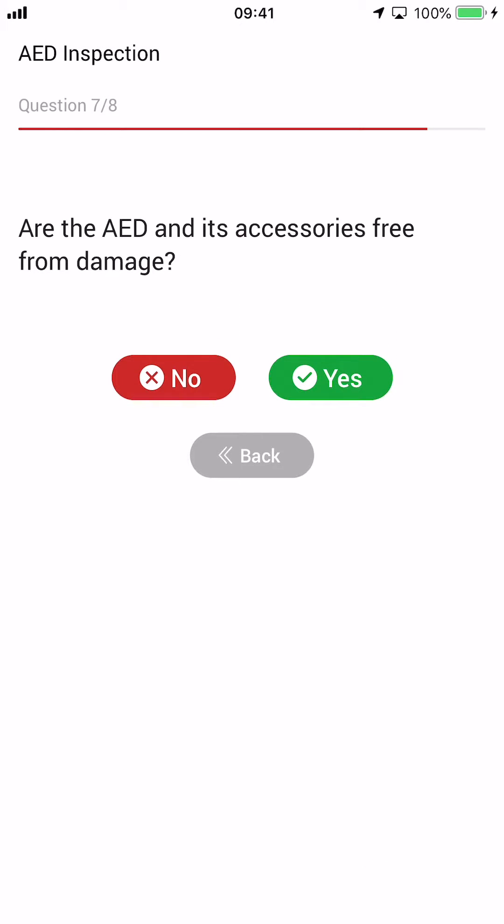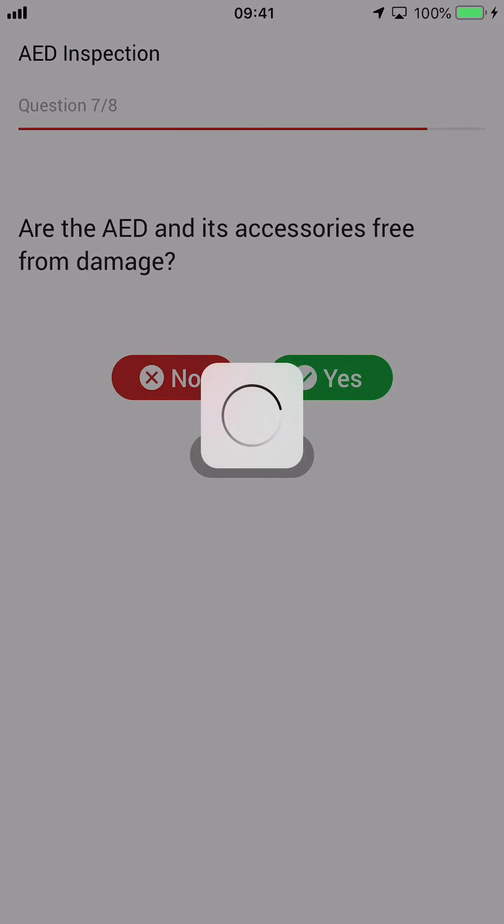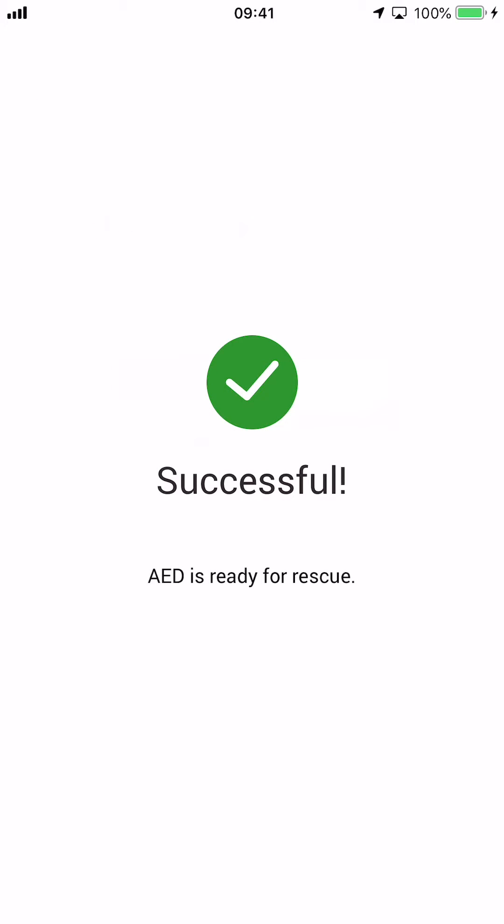Once you've completed all of the questions, your AED inspection is complete. Thank you again for choosing AED365 to help keep your AED program alive.